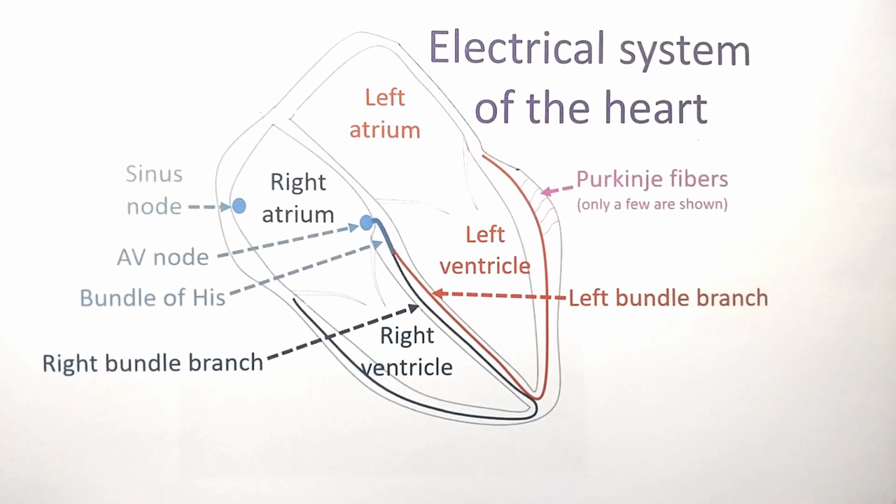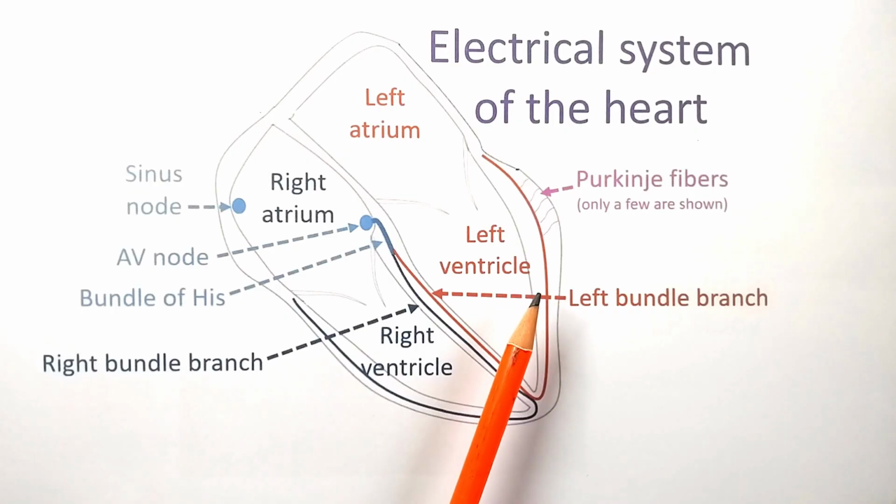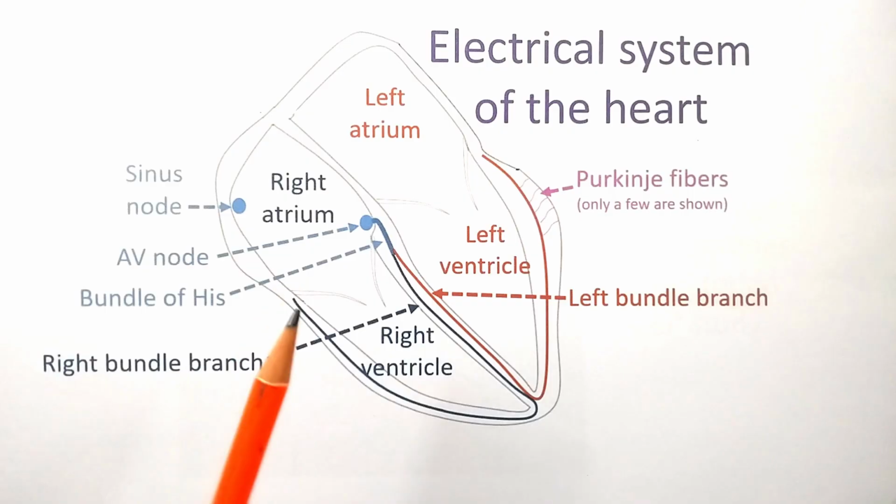Electrophysiology study will tell you whether the conduction from these in this sequence is correct or there is a block of conduction somewhere, and whether there are abnormal focus originating. Instead of the sinus node, sometimes focus can originate from the ventricle. Sinus node may be slow and abnormal focus can originate from ventricle. Then it is known as ventricular tachycardia, which is a dangerous condition. All these can be assessed by electrophysiology study. Conduction abnormalities and heart rhythm abnormalities. Fast rhythm and slow rhythm.